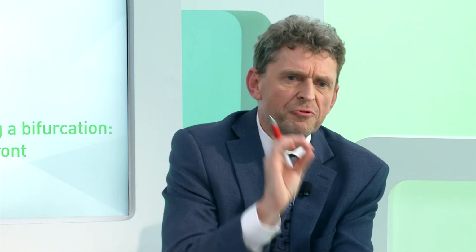Maybe one more comment. You should not be afraid of losing a side branch with a rota, a single wire, because what you actually do is break the calcium, and if you take a bigger burr, you debulk the plaque. So you remove the plaque, so it's really very rare that we lose the side branch after rotational atherectomy of the main vessel.